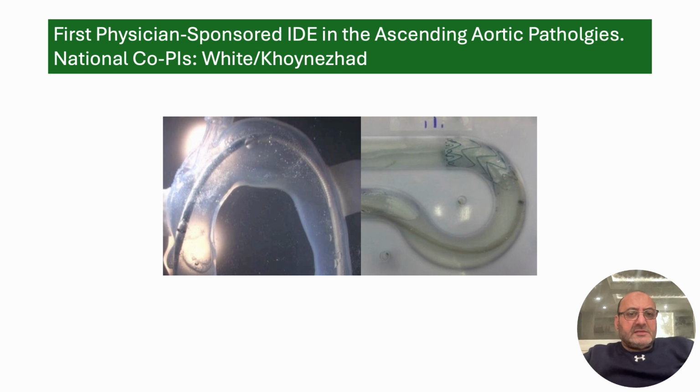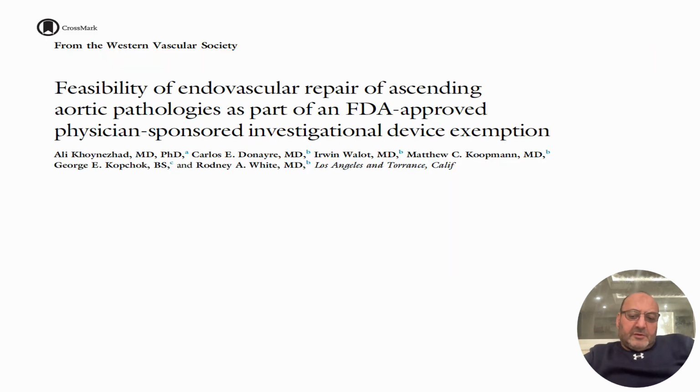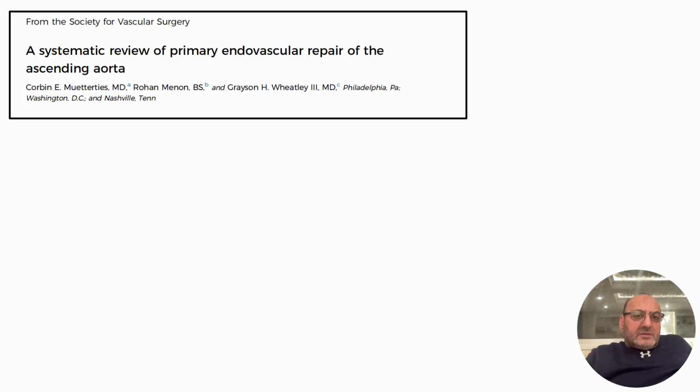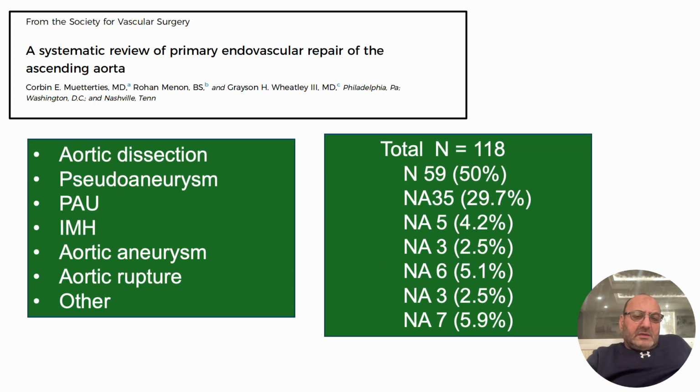Initially they did this with 3D printing, and they made sure that the device can be delivered and deployed. The feasibility study was published afterward, showing, based on 6 patients, successful deployment, 1 mortality, and 1 stroke. And in 2017, Dr. Wheatley published a meta-analysis with 118 patients.